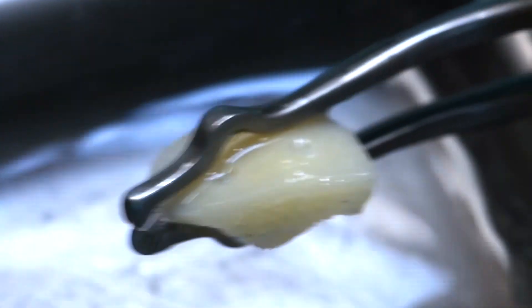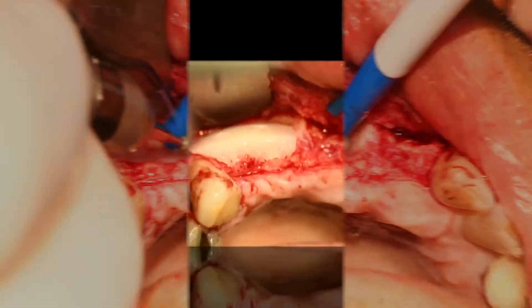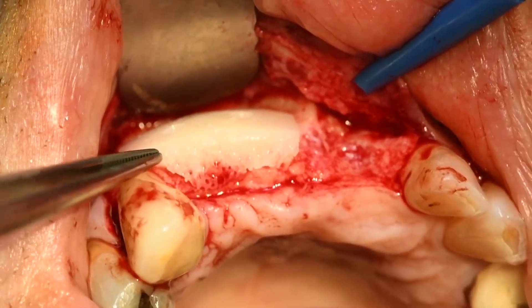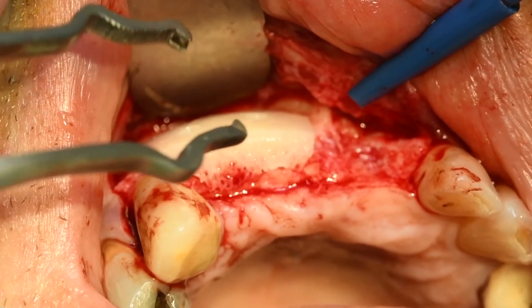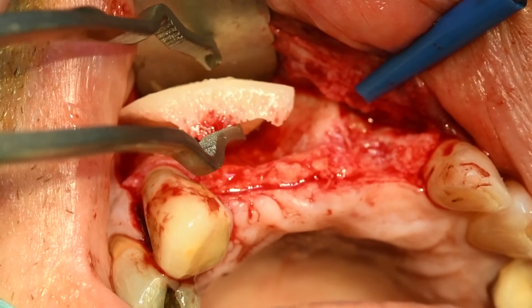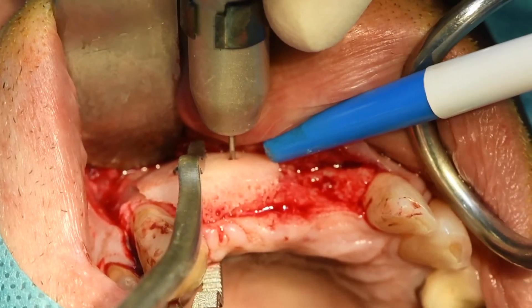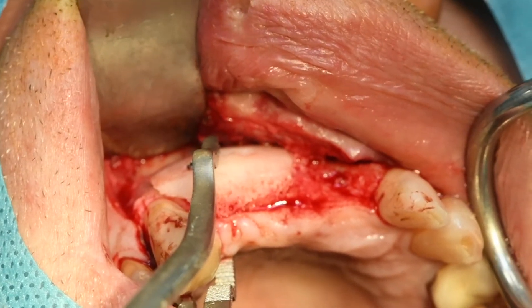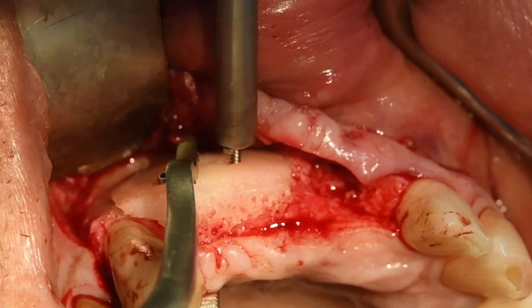Ça c'est juste pour noyer la tête des vis. Voilà. Donc là on est un petit peu en sur-contour, on va corriger ça, parce que c'est un peu trop... Et au niveau de la racine aussi, c'est un petit peu trop près. C'est bien. La vis était peut-être pas bien mise.